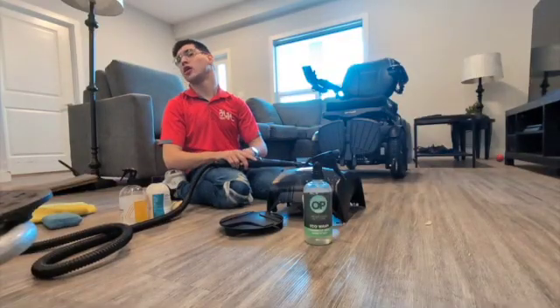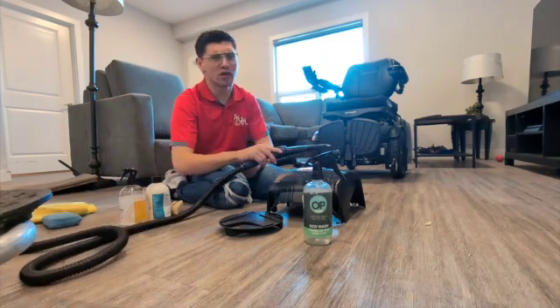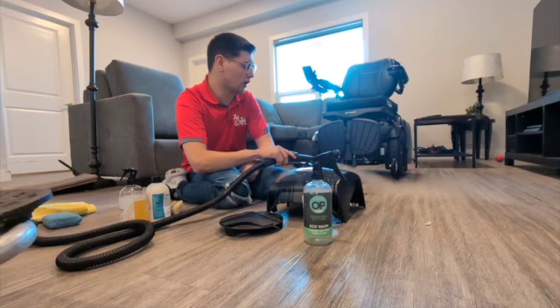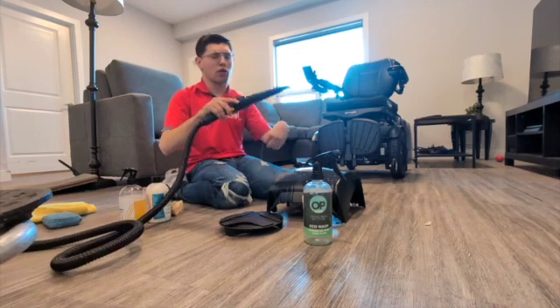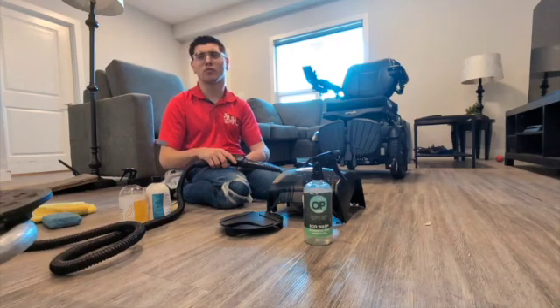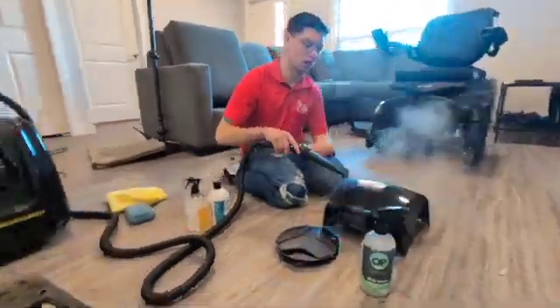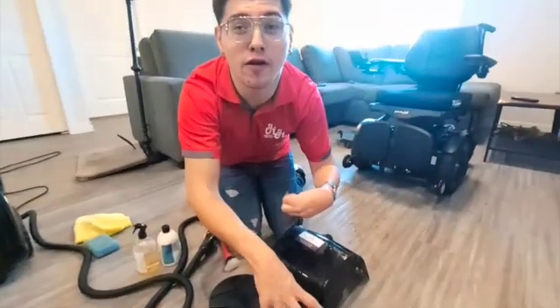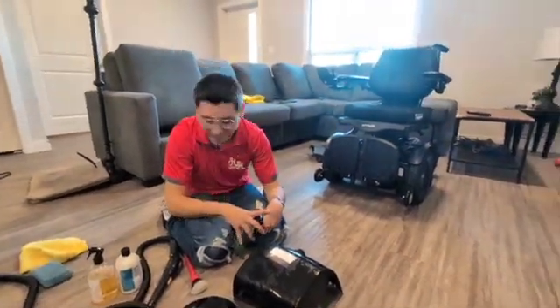With this steamer, the first time you spray, the water always comes out first, so aim it off the surface. Press the button until a good amount of steam comes out, and then just work your way around it. You don't want to get it too hot because it's plastic and it will deform and melt, so be real careful. And don't put it on your leg because that kind of hurt. It's pretty hot.